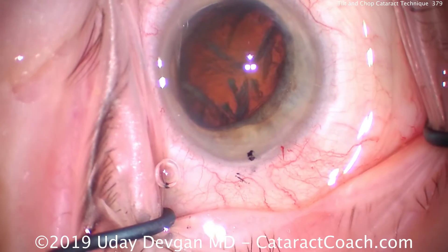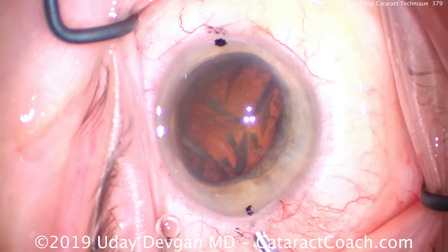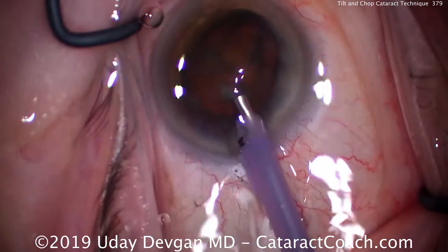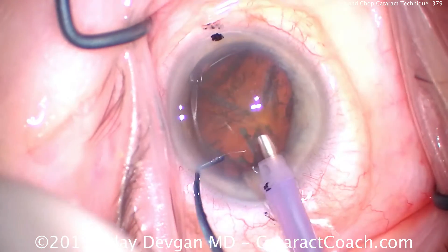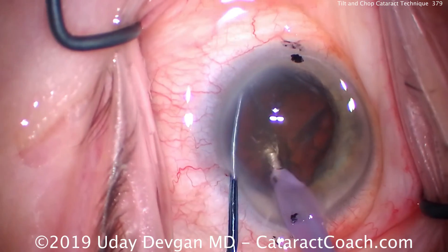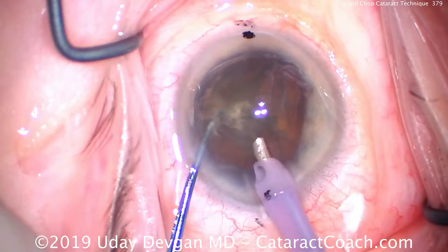That's more dispersive viscoelastic that just went in. Here's the phaco probe — high vacuum, high flow, moderate phaco power. At least 400 to 500 millimeters of mercury of vacuum and about 40cc per minute of flow. The phaco probe is buried deep. The chopper goes around the nucleus equator and then the nucleus can be chopped.